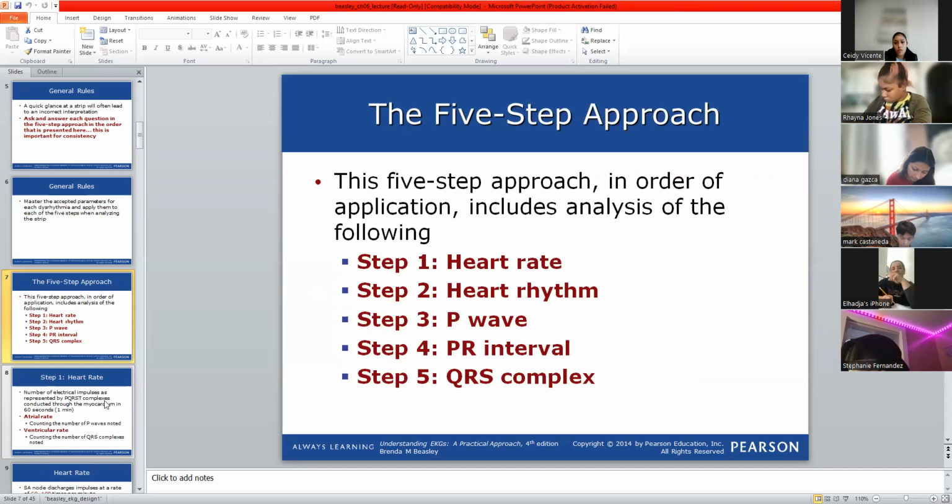And we learned something. Yes, very good. You are so smart. Al-Haja said that I will count how many are in 6 seconds and multiply by 10, and I will get the heart rate. Excellent job. After that, we are going to mention whether it is regular or not. What do we mean by regular? Like I told you, rhythmic, like the pendulum of the clock: regular or irregular.